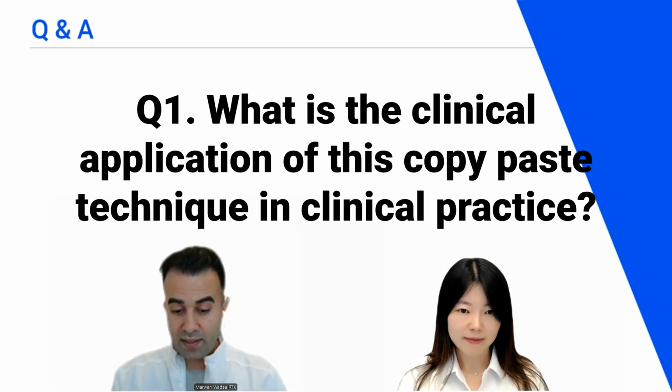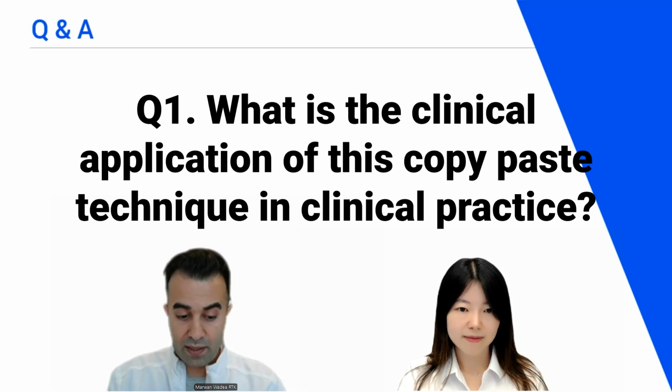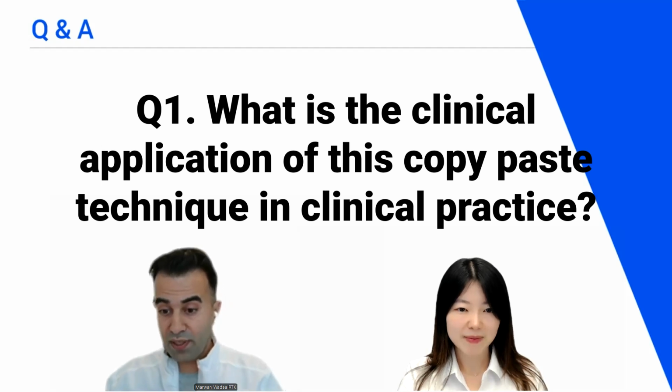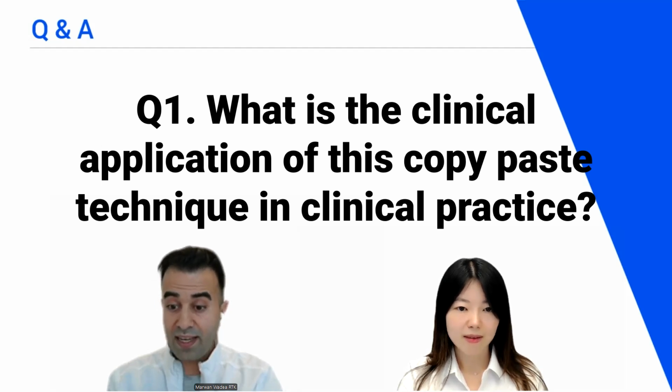Then the next question would be, does any of her daughters, for example, have a similar smile? And you would see some patients would say, I would love to have a smile like my daughter's. And that usually would resemble their younger selves. Before, in the past, in the analog workflow, these things were really impossible to replicate. And that's what we can actually achieve with this technique.